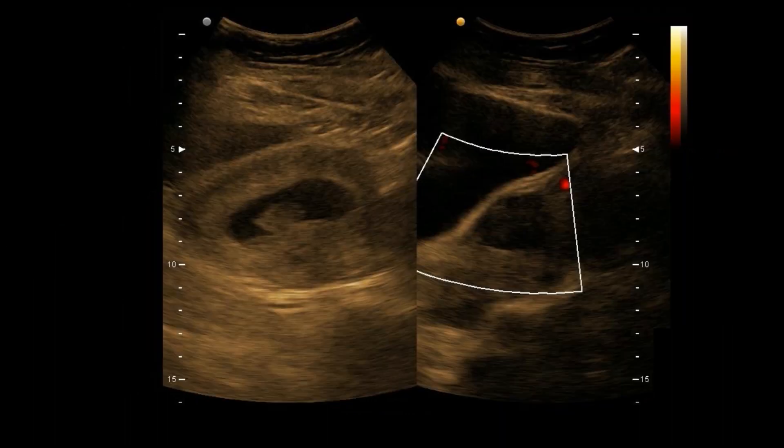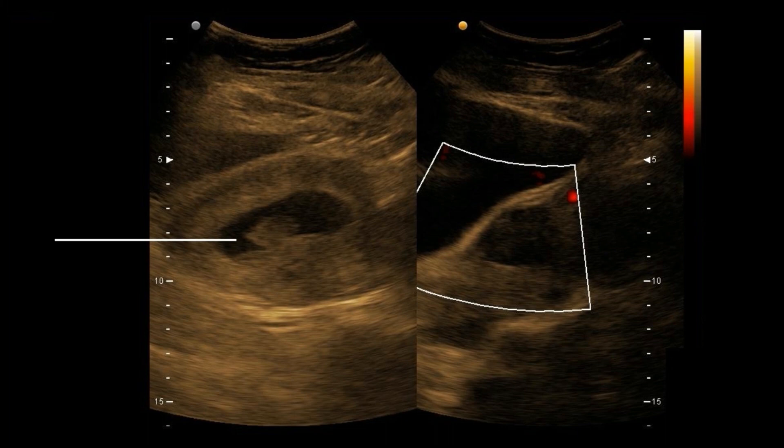On the left picture, you can see the embryo within the gestational sac, and on the right, we can see the hypoecogenic fibroid.